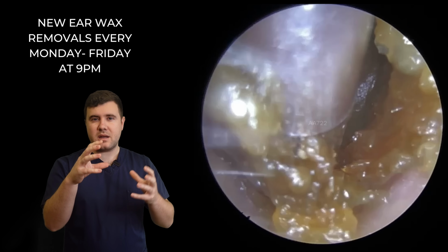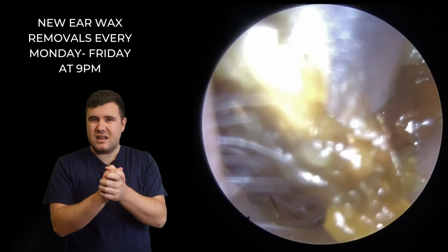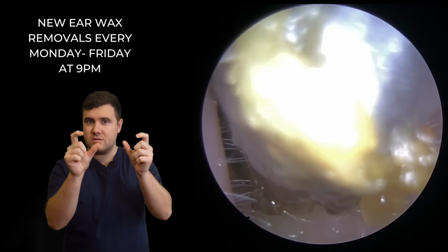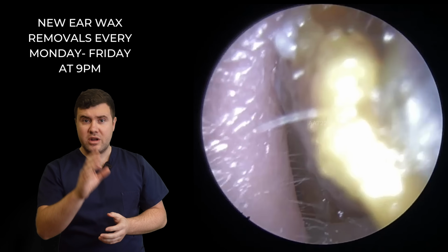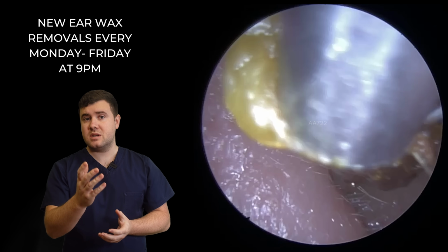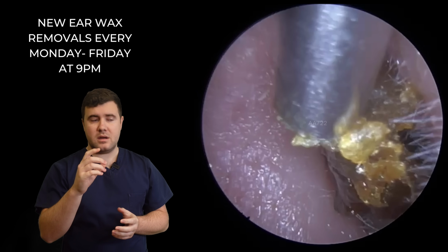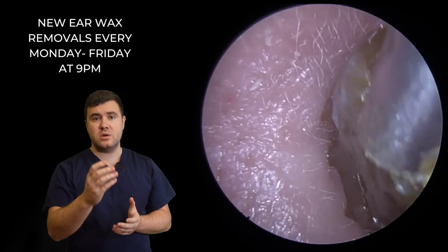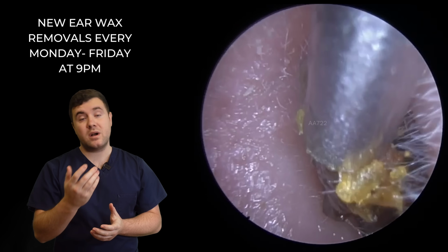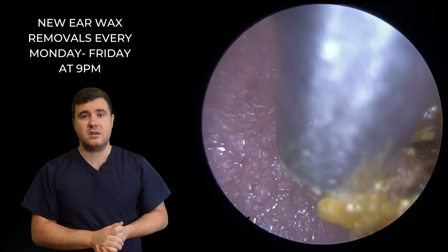So we've got this kind of drier wax in this ear. A little bit of dry dead skin around the outer edge there, little lighter parts on the edges. But this straight away is coming out quite easily for us. Patient's been using some olive oil beforehand, which helps massively. In clinic here, we only usually suggest around about 5 days of olive oil use before coming into clinic. This can be done dry, but it's a lot easier when oil's been used.